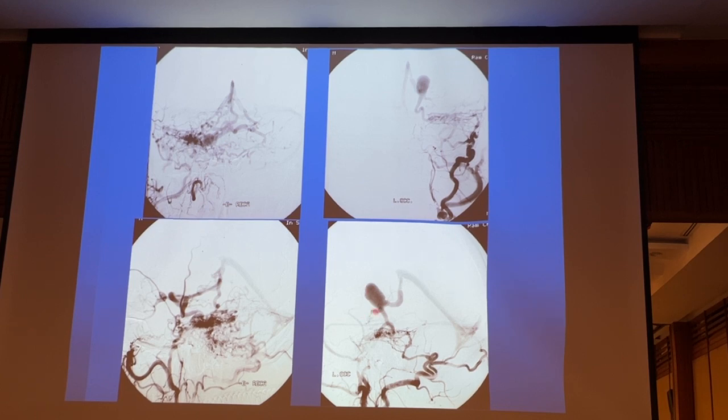A huge venous aneurysm in this case. We did transarterial approaches with glue first because this is before the era of Onyx. Okay? So we did as much as we could, and because of the extensive pial venous outflow, the remaining part we sent for surgery.